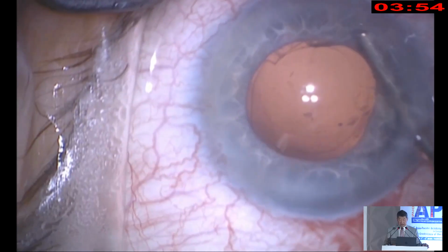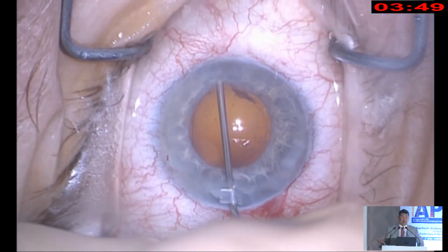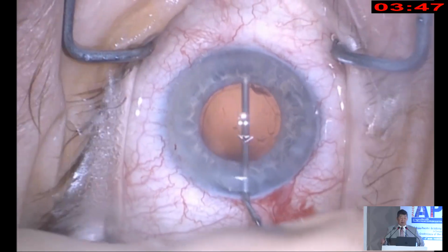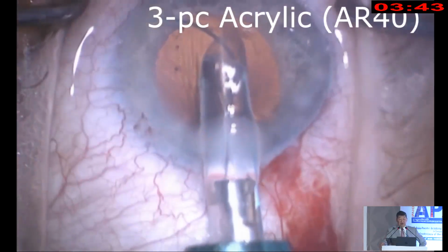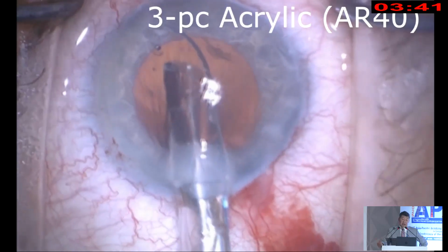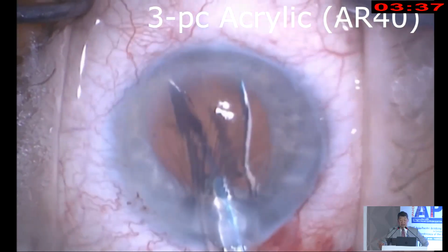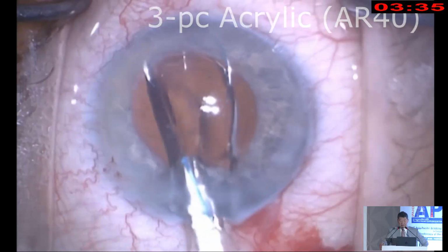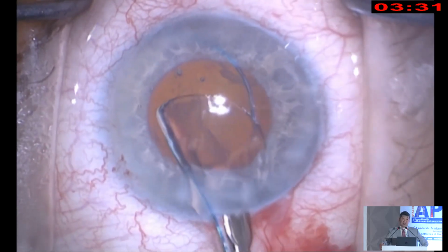These are MST capsule forceps, and they're very controlled, and I love being able to go through a paracentesis site so I don't burp out the viscoelastic, causing the chamber to shallow. And I think you can see here I'm trying to put viscoelastic to open up that space in between the iris and the anterior capsule, and this again lets me get into that space. So it is important that the rhexis isn't too small.